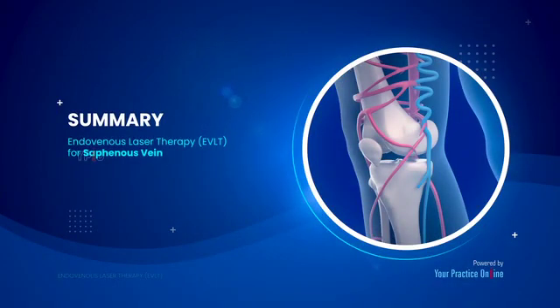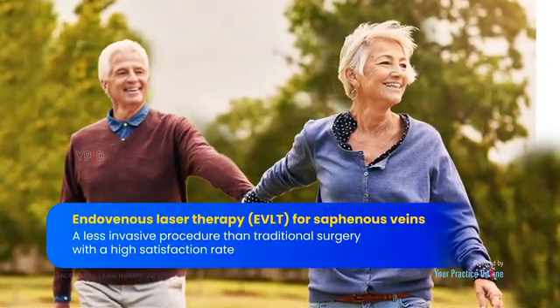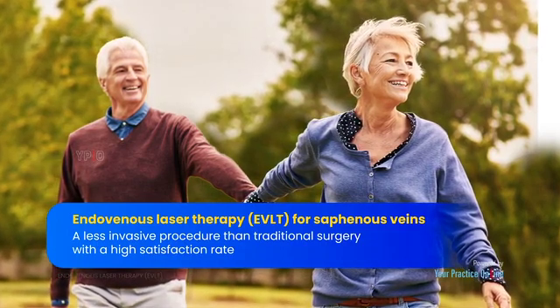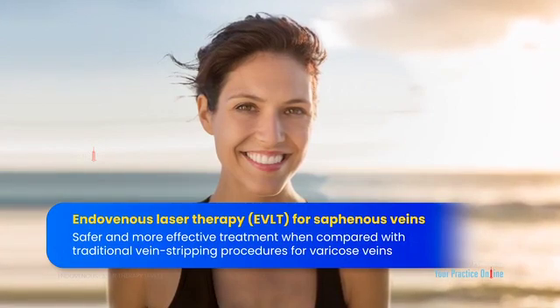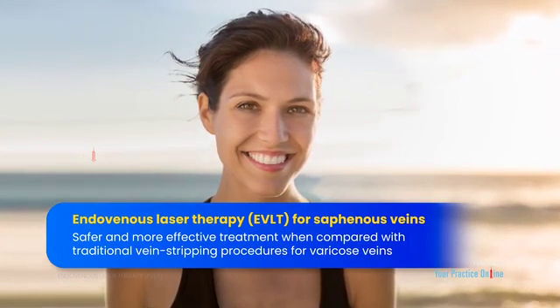Summary: endovenous laser therapy, EVLT, for saphenous veins is a less invasive procedure than traditional surgery with a high satisfaction rate. It is a much safer and more effective treatment when compared with traditional vein stripping procedures for varicose veins.